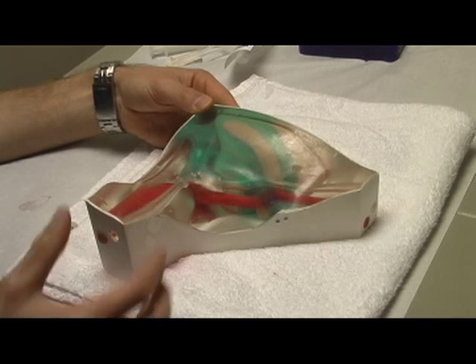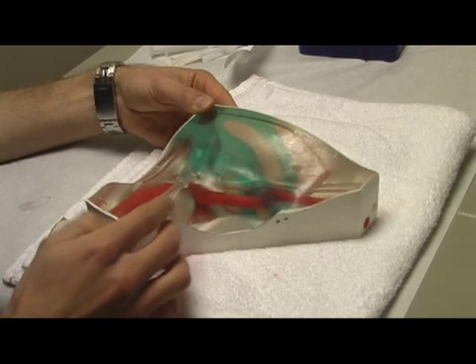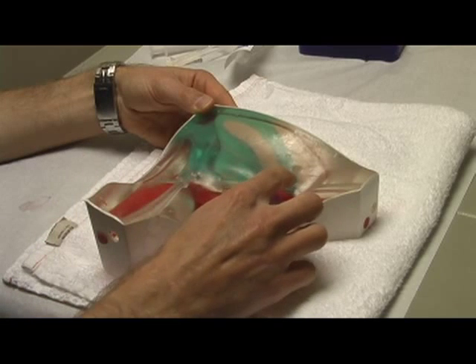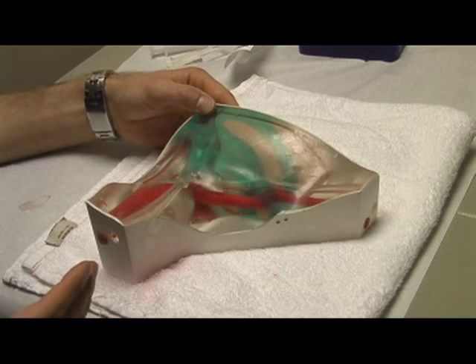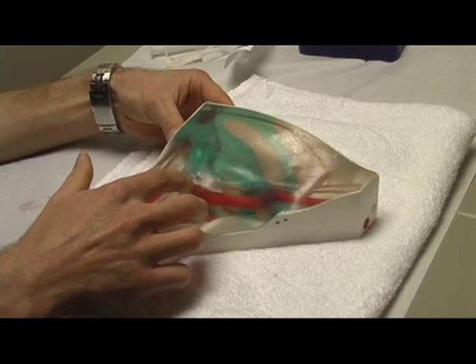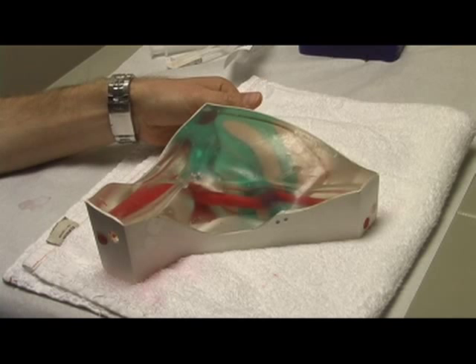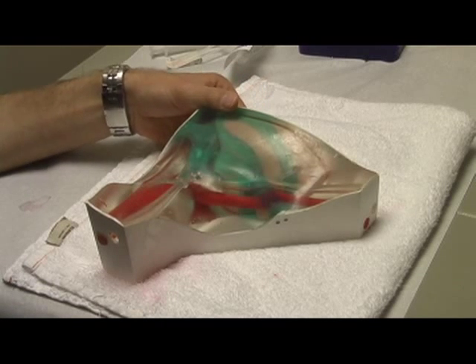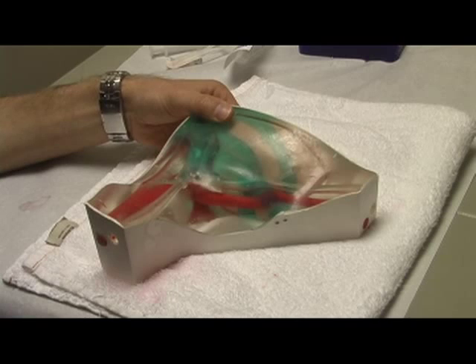There are these ports at various locations, one for an IJ, one for a subclavian, and the students can practice introducing a guide wire through these ports for practicing central line placement. The obvious limitation here is that it's extremely artificial and does not realistically recreate the experience.